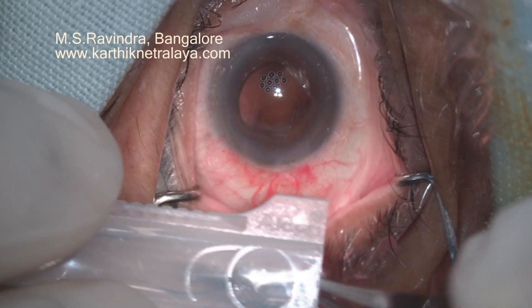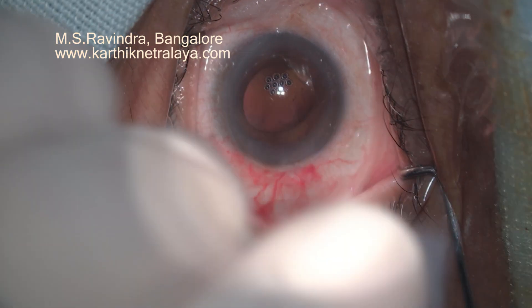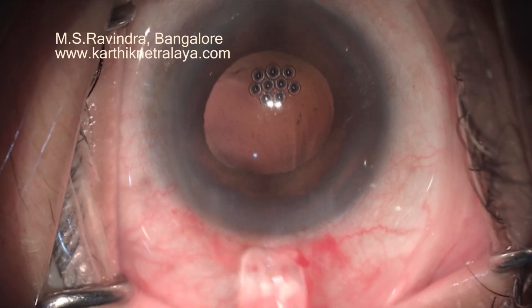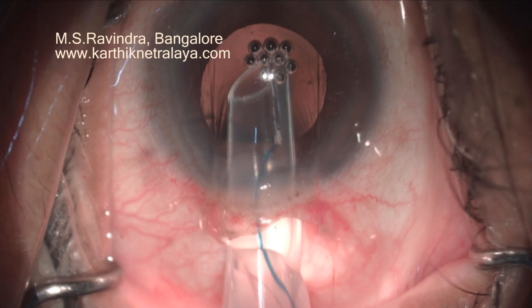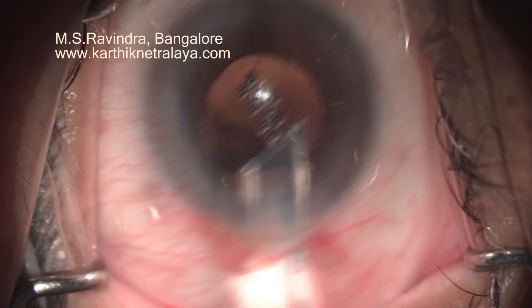There's another eye. It's folded convexity downwards. Push it as anteriorly as possible with a rod — it can be anywhere from 17 to 19 gauge. Pronate fully and then slowly supinate; the trailing haptic is delivered in the bag.